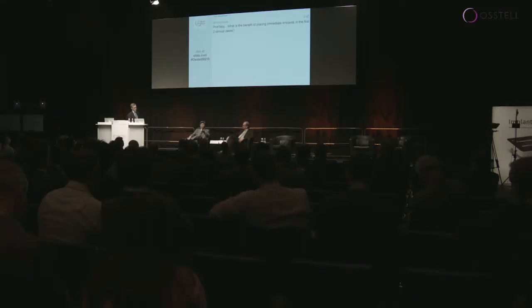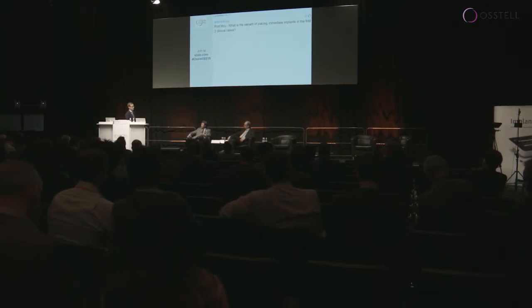Number two, it allows faster treatment time. So instead of allowing the socket to heal, coming back and placing the implant, therefore having the tissue heal two times, rather than with no flap, there's, we feel, less tissue recession as well. Now, that's the benefit of placing the implant right away. The other question is, what is the benefit of provisionalizing those implants? And so that is a separate issue. But that's the two main reasons why I place immediate implants.